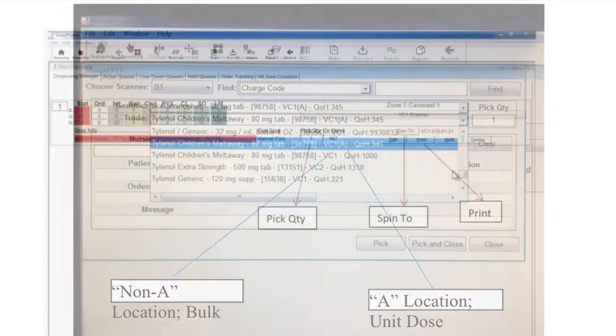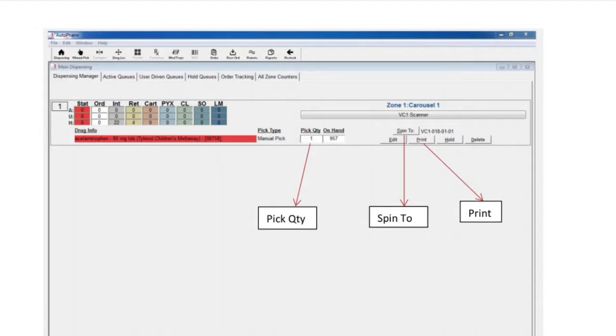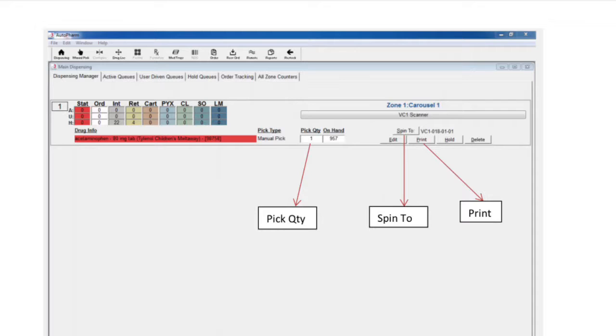Once you have selected the medication, change the pick quantity to how many you are going to be removing from the bin. The pick quantity is very important. Inputting the correct quantity removed allows the carousel to reorder accurately. Remember, the primary function of the TALIS system is to maintain and reorder inventory.